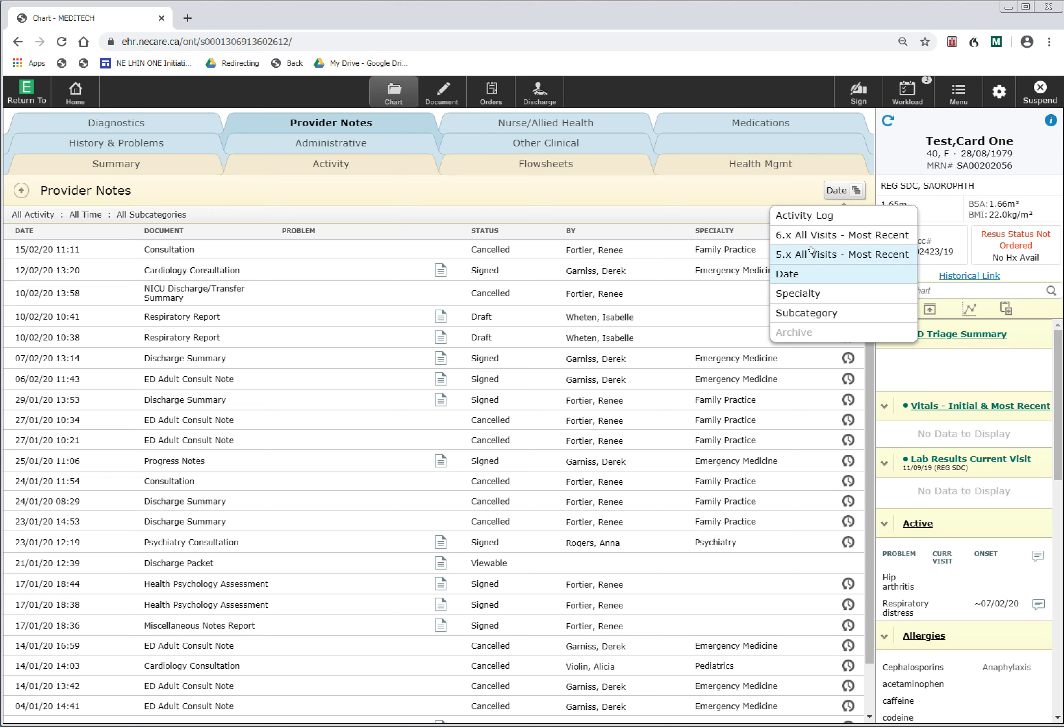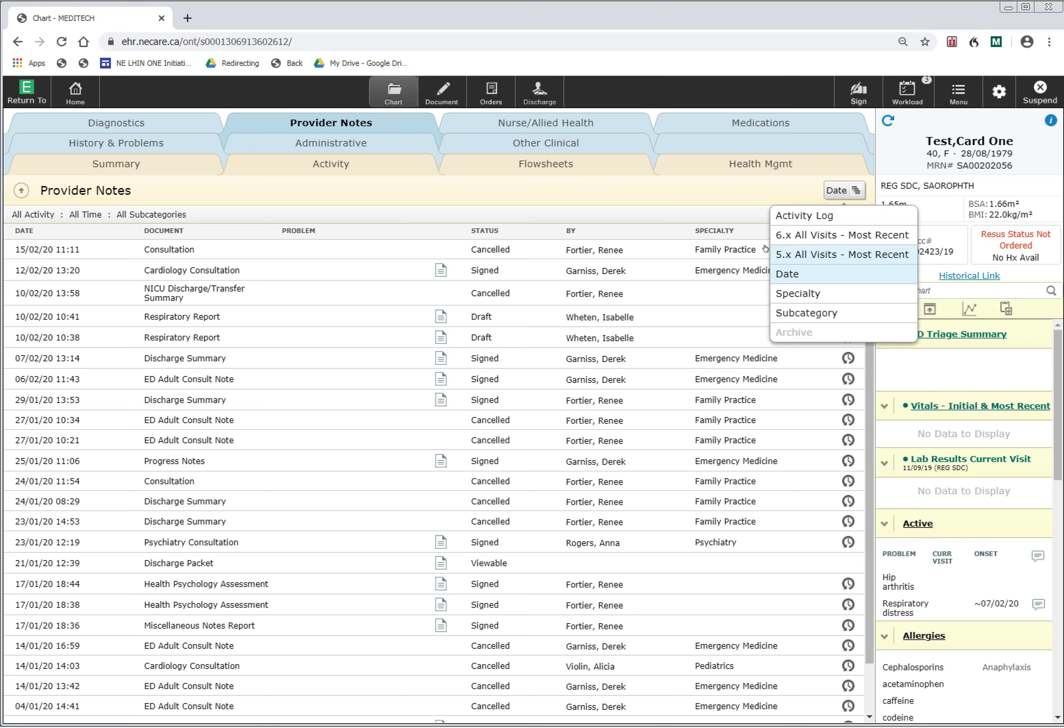The section 5.x All Visits will be highlighted if there's data in the old system on this patient. If there were no data on this patient, this 5.x All Visits would be low-lit, as it is down here under Archive. Since the 5.x is not low-lit, we know that there is data in the old system on this patient.